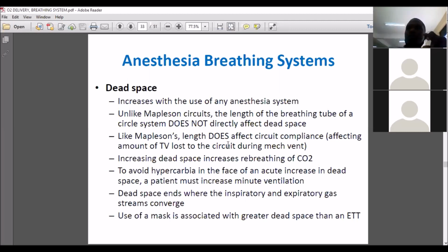So this dead space is where you breathe in and breathe out, okay? That tube is all your dead space. If I add your tube, I'm adding more dead space. So you should be given more oxygen and you should also be breathing faster so that you can remove the carbon dioxide from the dead space and you don't rebreathe. And also the oxygen I'm supplying becomes enough. I have to increase it.